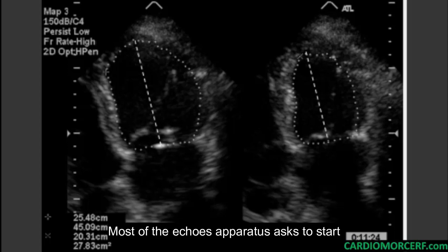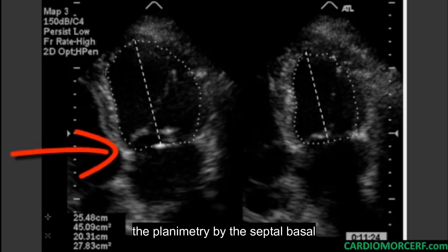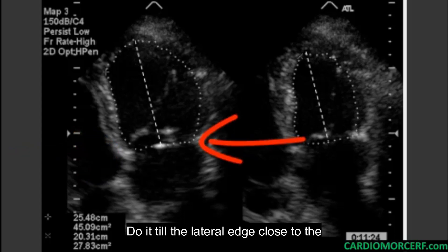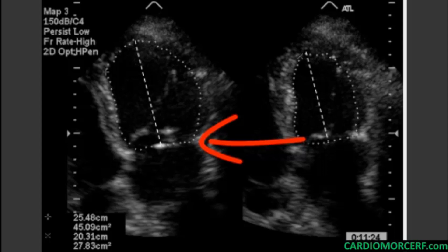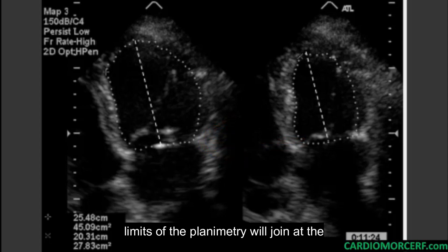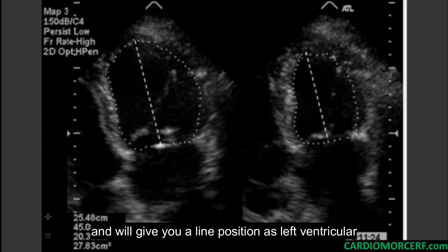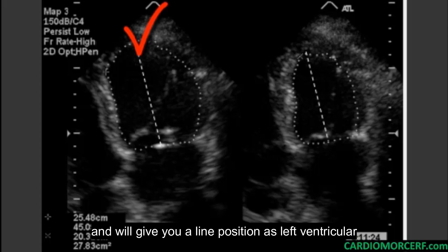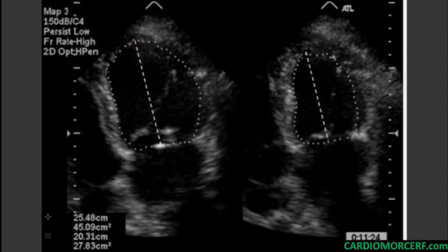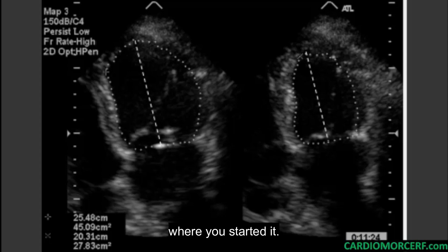Most echo apparatus asks to start the planimetry by the septal basal endocardial border. Do it till the lateral edge close to the mitral annulus. Then you just push a button and the two limits of the planimetry will join at the annulus plane and will give you a line positioned as the left ventricular length for you to accept or adjust it.